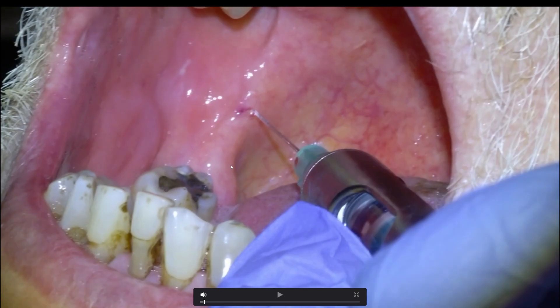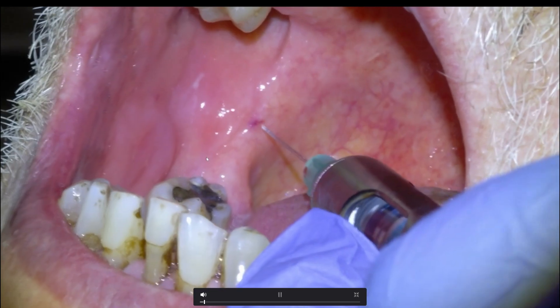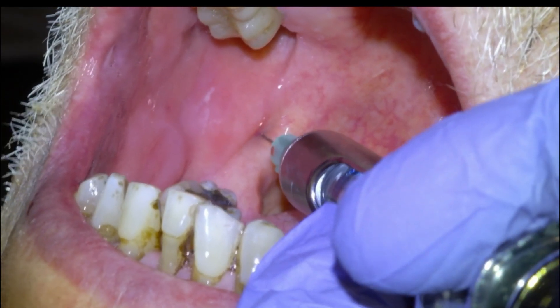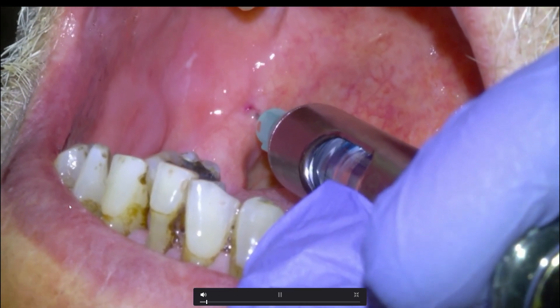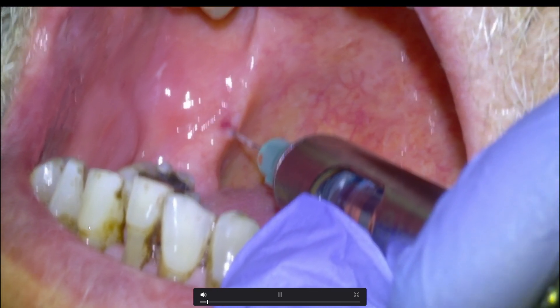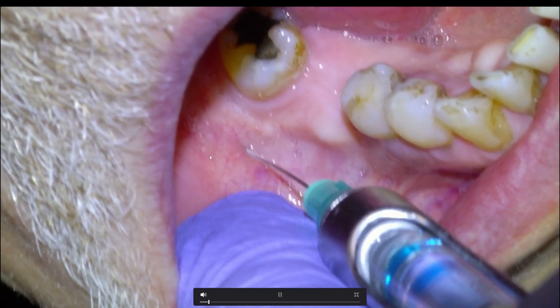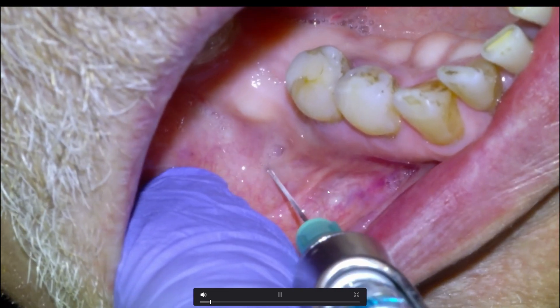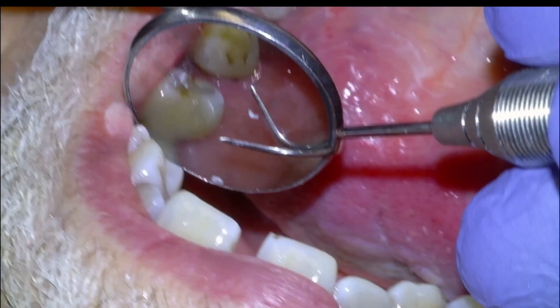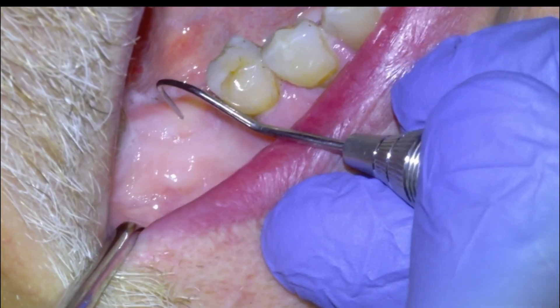We'll get into the footage here — I'm going to include most of the raw footage and just fast forward through the boring stuff. We'll get started with a cartridge of 1-in-200 articaine into the mandibular nerve. You can see there's a history of periodontal disease, but it's been well controlled. He went to a periodontist to get it under control and it's been stable for some time with no mobility in any of the teeth. We'll get our cartridge into the mandibular nerve and then infiltrate buccally with the 1-in-200 articaine, and then a quick rinse.